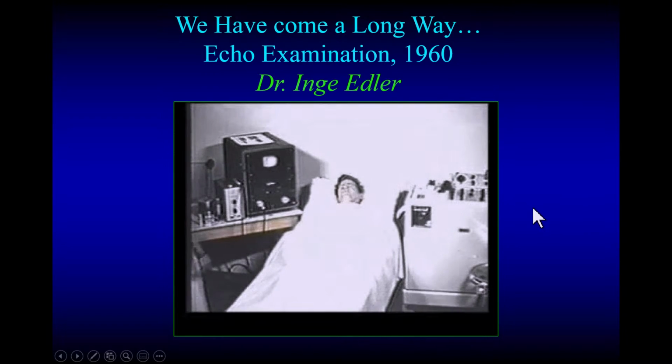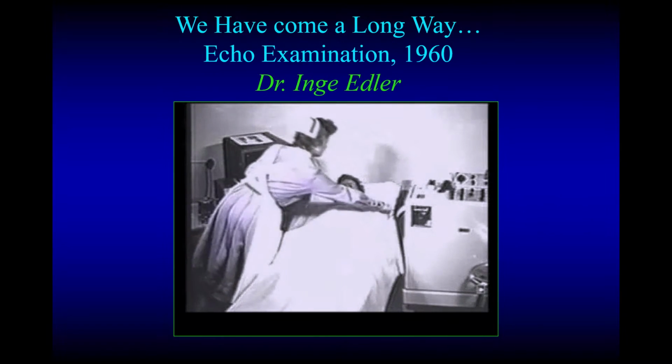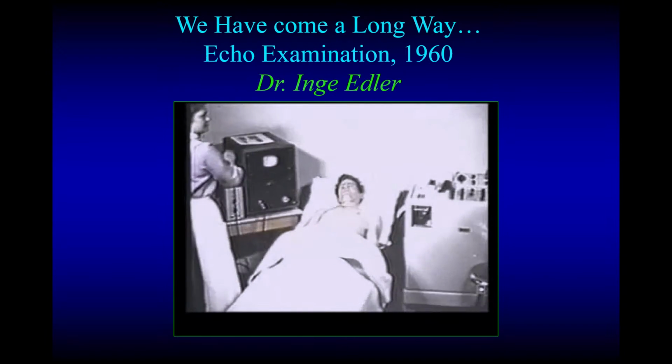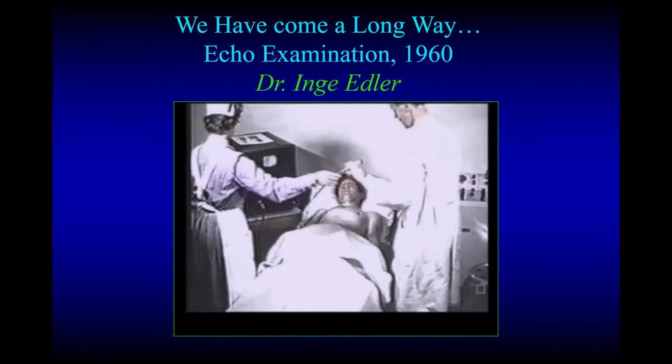And this is from Dr. Inge Edler himself and his assistant, examining a patient with ultrasound technique.